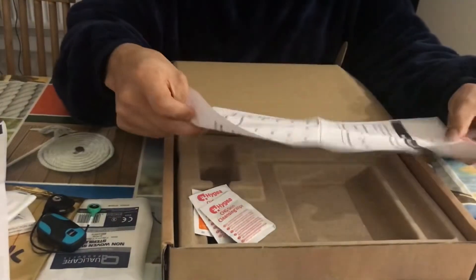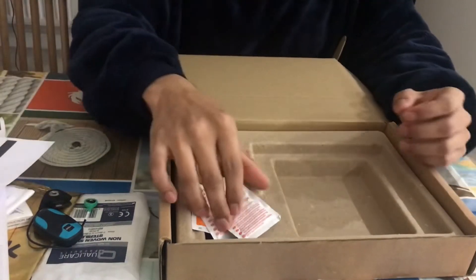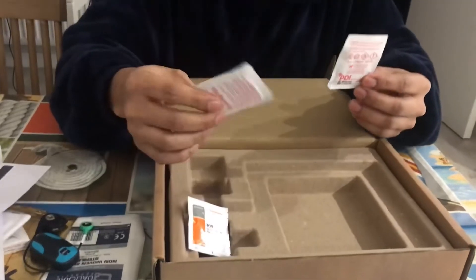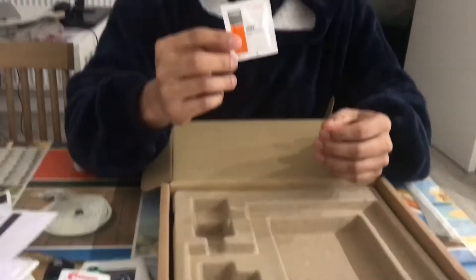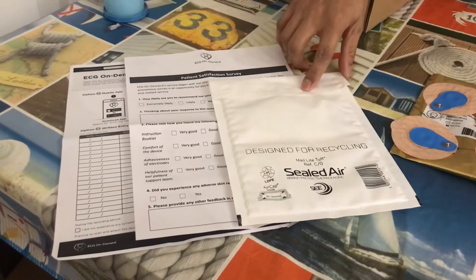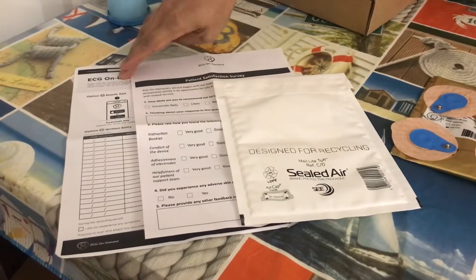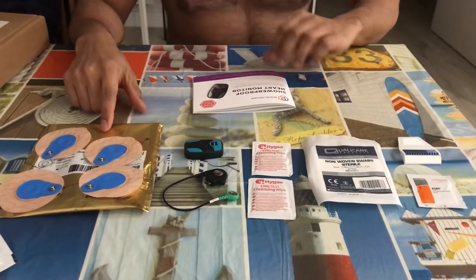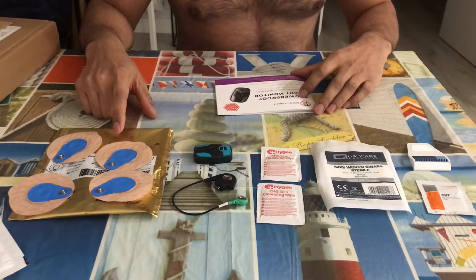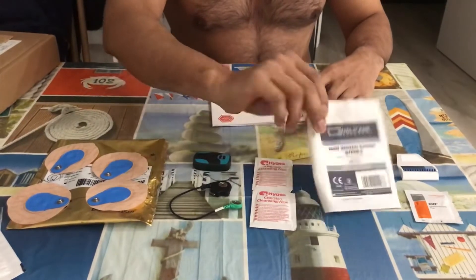There's also a patient satisfaction survey, which I think will be worth doing at the end of this process. So here I have four electrodes — I just need two, but I think they have given two extra in case one gets damaged or comes off. Then there's the cable and two wipes.